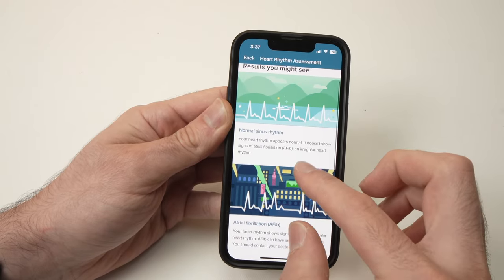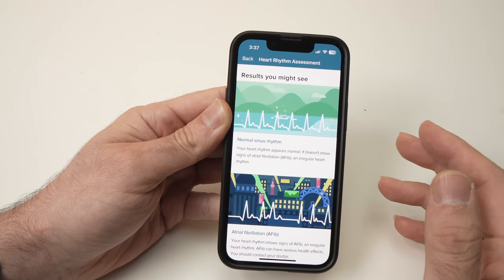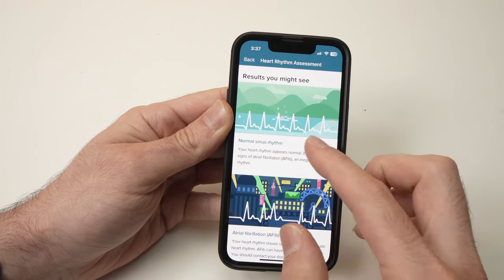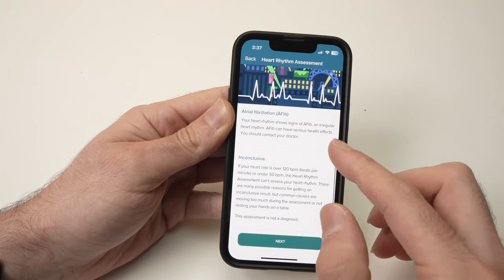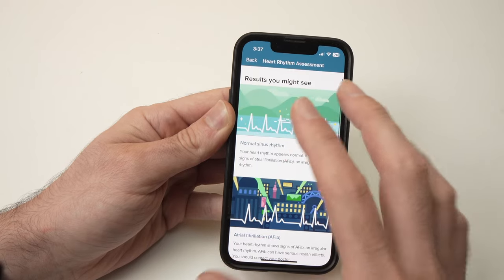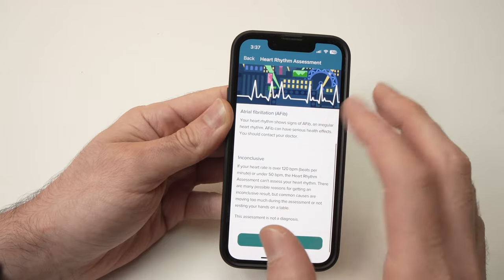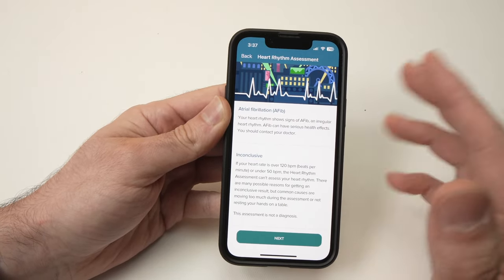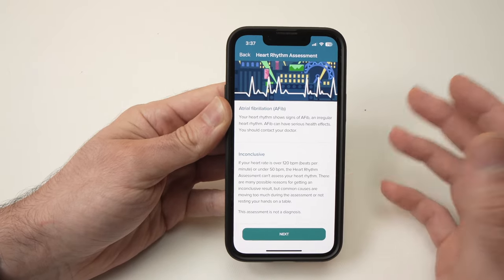The next screen will tell you what kind of results you can expect from the ECG. You can get Normal Sinus Rhythm, Atrial Fibrillation, or Inconclusive. I suggest you take time to inform yourself about each result, since I'm not a doctor and can't explain what each of these means.